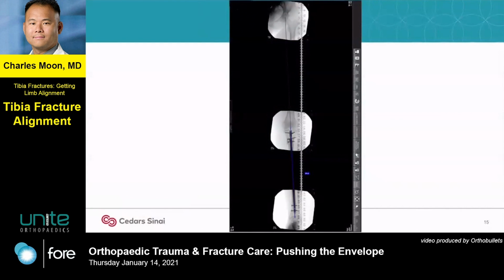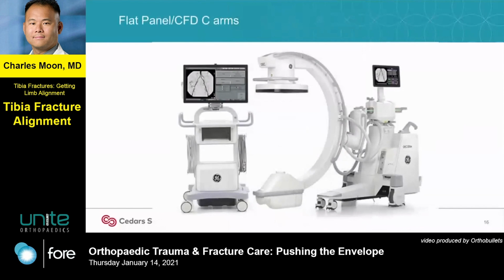And this is the kind of thing you can get. What you see here is an image with a ruler on one side and an electronically software-generated plumb line going from the center of the hip to the center of the ankle. The way we do this is we utilize one of our flat panel C-arms. It doesn't work as well with the regular C-arm. With the regular C-arms, you do get quite a bit of parallax out at the edges. With the flat panels, you do not. So these are those square panel C-arms.